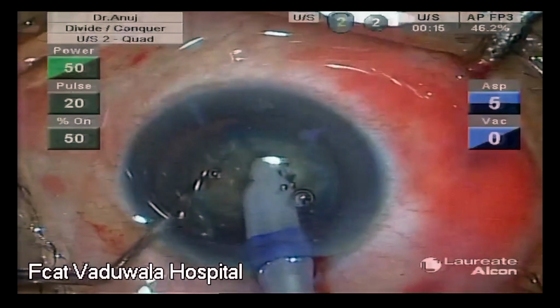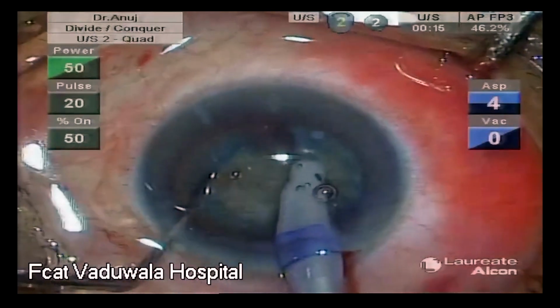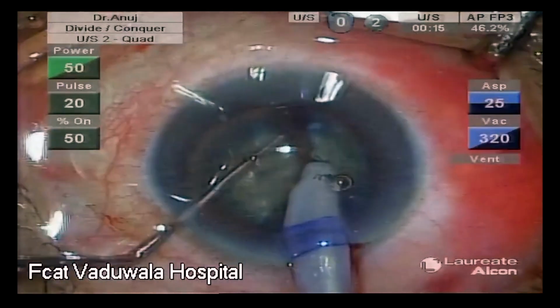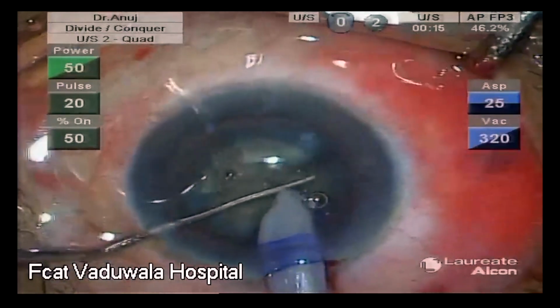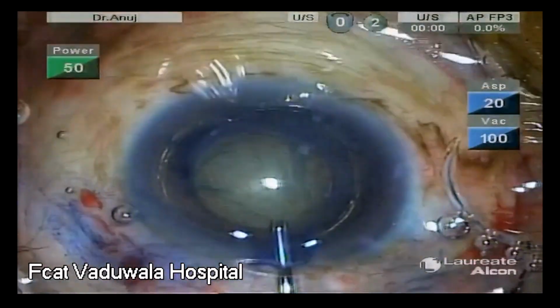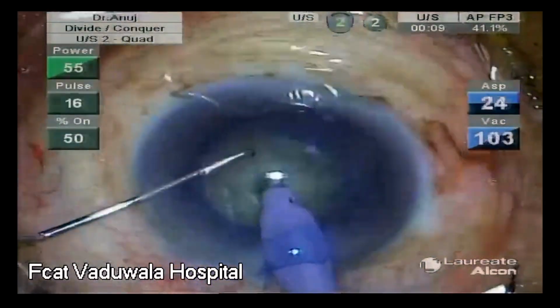You will notice that both the phaco tip and the Sinskey stay inside the rhexis margin and they exert an equal and opposite force, leading to a complete crack in the nucleus. So firstly, we need a circular rhexis with perfect hydrodelineation, which makes the nucleus spin around like butter.